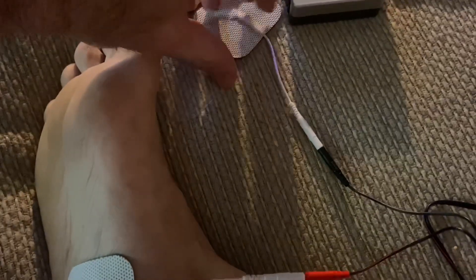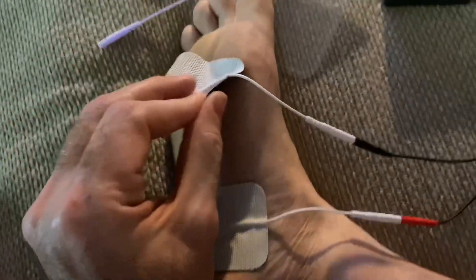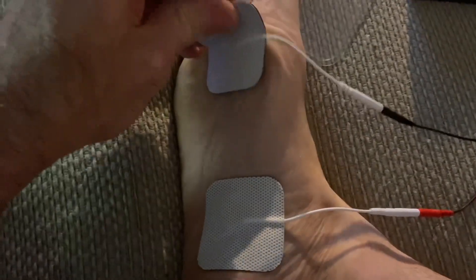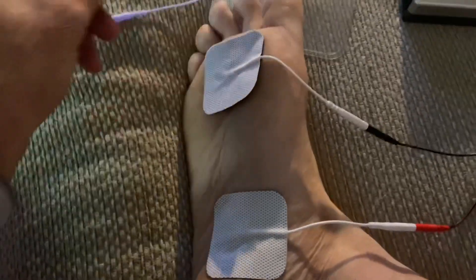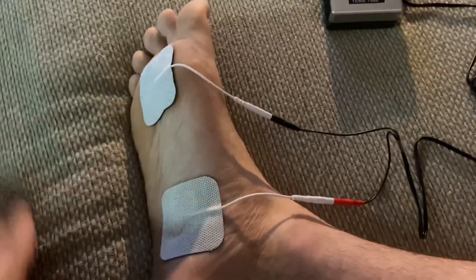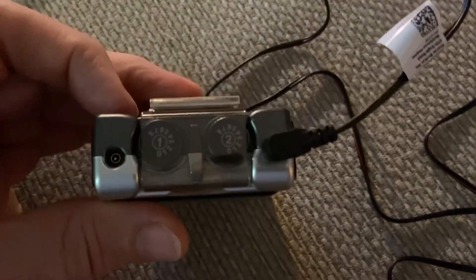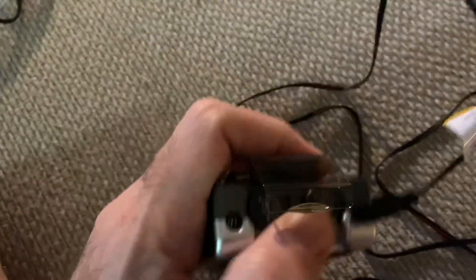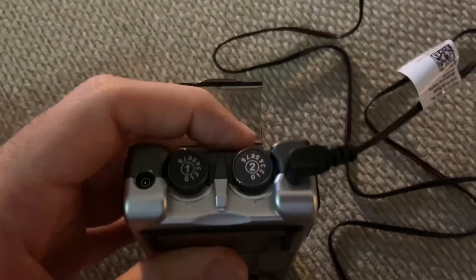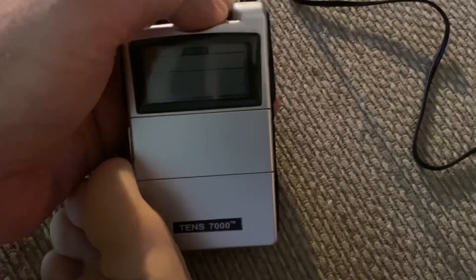Because you can electrocute yourself. Even though it says mild tingling, if you crank these up you really feel it and it's not comfortable. I've played with one of these before and was quite surprised what a little 9-volt device can do. This one is pretty cool — it's got two channels, one and two, so I could have two running at the exact same time. Right here I can turn up the intensity. Let's just turn it on and see what happens.